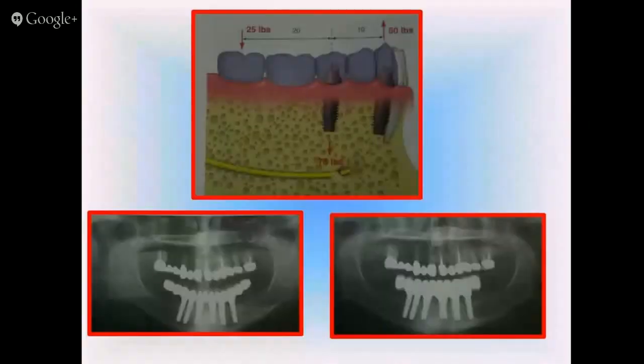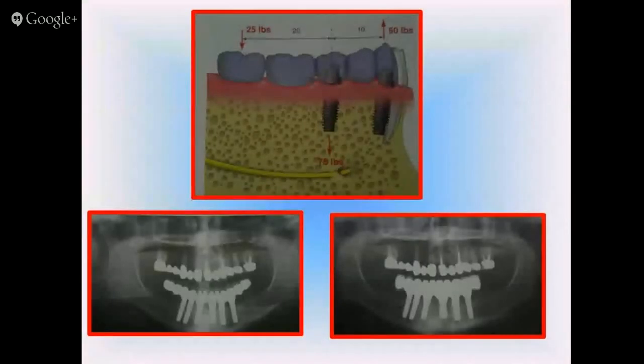Okay, this is important. Now, just to evaluate a case, this is a patient who walked in stating that there was an abutment screw loosening happening probably every 2 months. And what we did was just the shortened arch concept. We made sure that the acceptable length of the cantilever is maintained. After that, the patient was on a 2-year recall, no abutment screw loosening happening. Because we knew what the problem was, we diagnosed the problem, made the corrections, the patient is happy, we are happy.